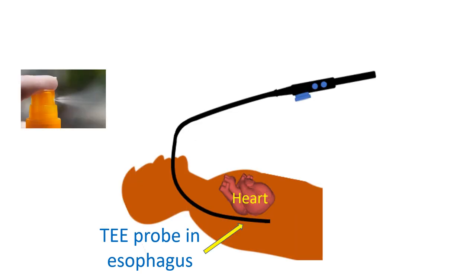Now, is there any disadvantage for transesophageal echocardiogram? The most important disadvantage is the semi-invasive nature. Some feel it uncomfortable to have the long probe introduced through the throat.